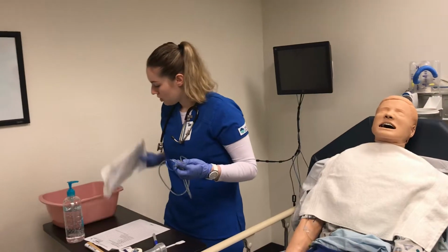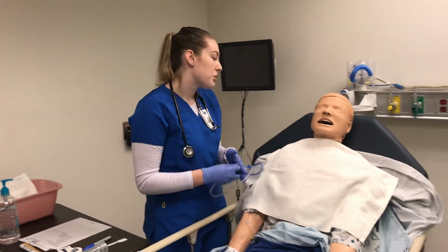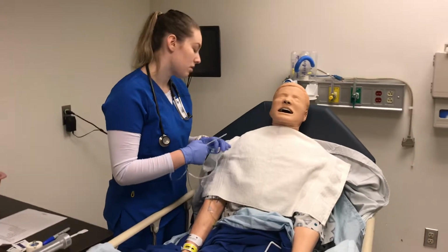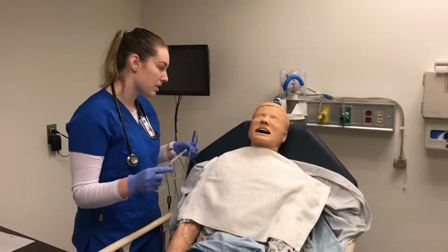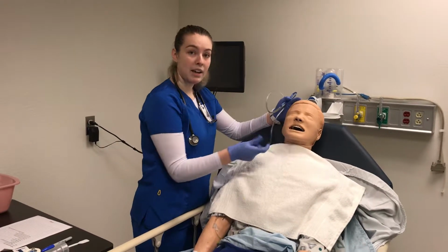Okay. So now we can get started. Shirley, do you have any questions before I begin? Do you have any concerns? No? Do you remember our hand signals? Yes? Okay. So I'm going to start with the head tipped back.